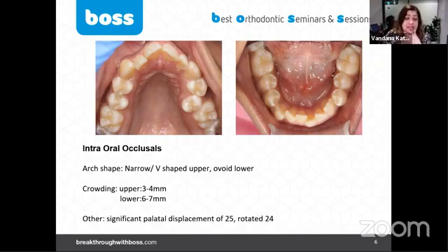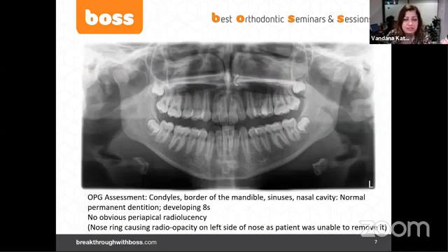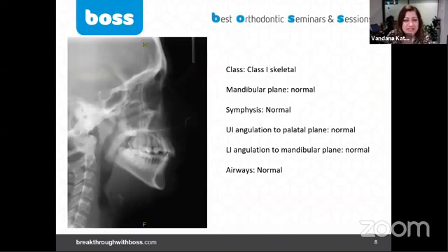The lower arch is also moderate crowding. On the OPG, nothing to note here — third molars are developing and a nose ring is obvious.